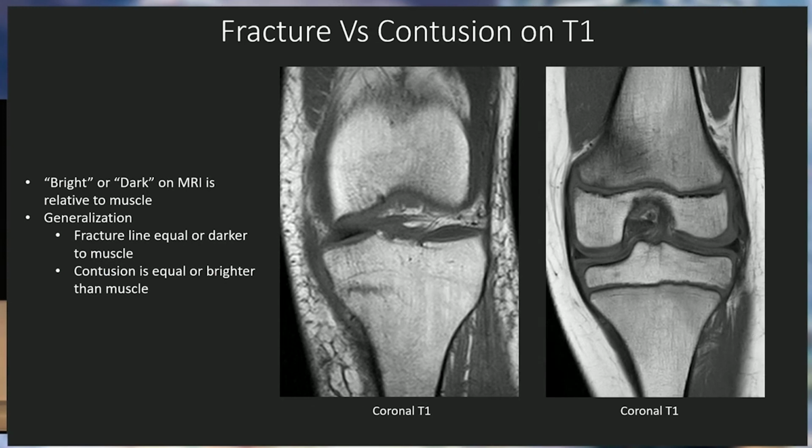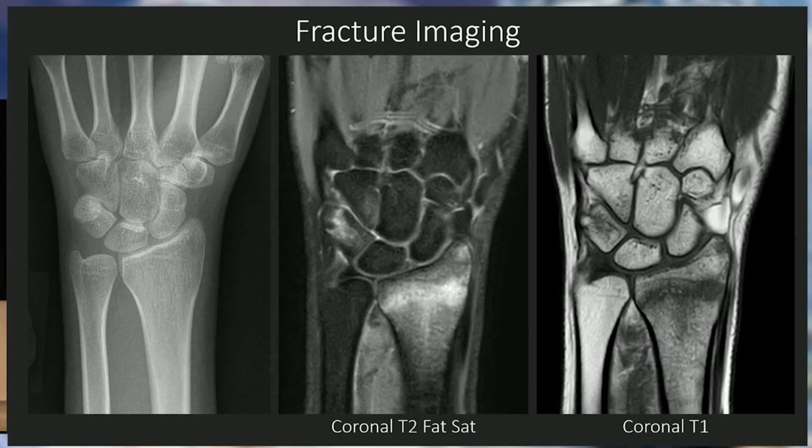In terms of stress fractures, I know we talked about that before, but again, going to that mechanostat theory, stress injuries, not direct trauma as in contusions, but stress injuries where there's chronic repetitive microtrauma, typically occur over time. So that bone is being overloaded. We're going to look for areas that are overloaded, and typically that's weight bearing surfaces, or an area where the periosteum is overloaded at a muscle attachment. So they differ from contusions in their location, but they're both going to be bright entities on a fluid sensitive sequence. Great images for this.